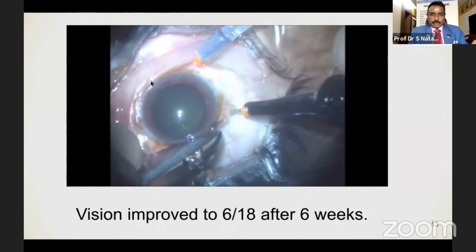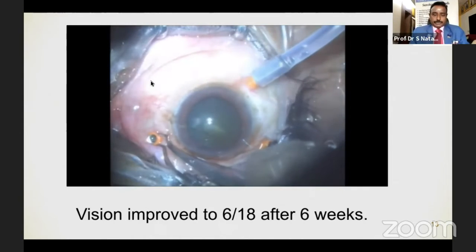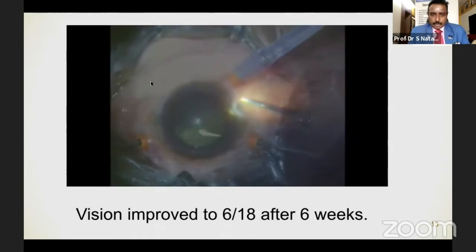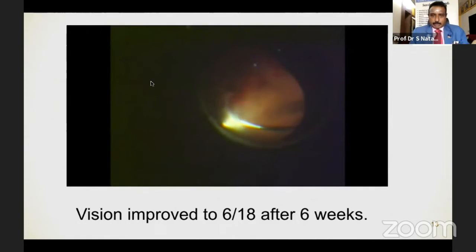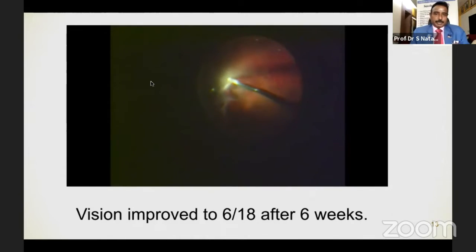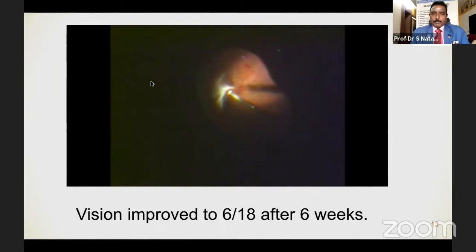You can see the phakic eye, and usually I don't like to do a combined surgery at that stage because in a diabetic eye, the lens still acts as a barrier, preventing the posterior vascular growth factors from migrating to the anterior segment. So if you have the lens in position and do the vitrectomy, and then in case the cataract becomes more dense, you can plan for a cataract surgery with IOL. In some eyes, you use silicone oil, where it can be combined with silicone oil removal.